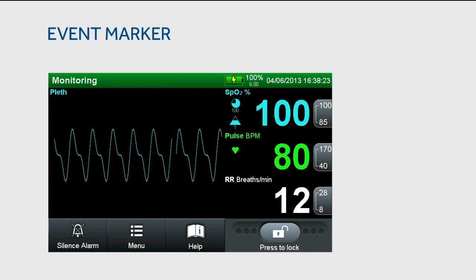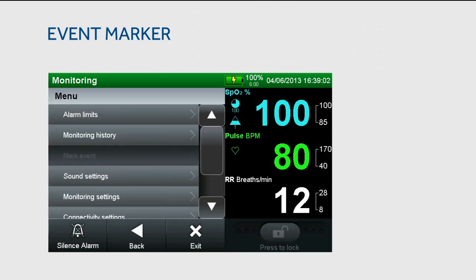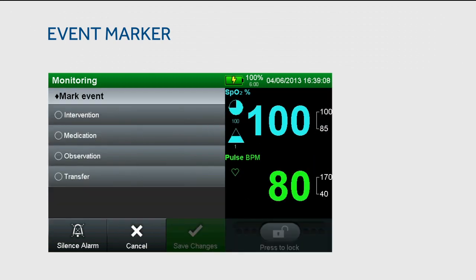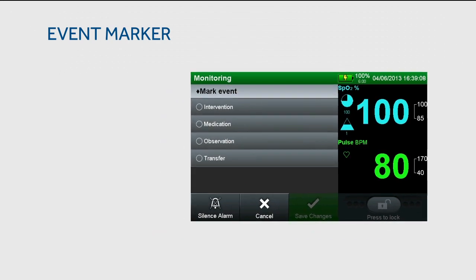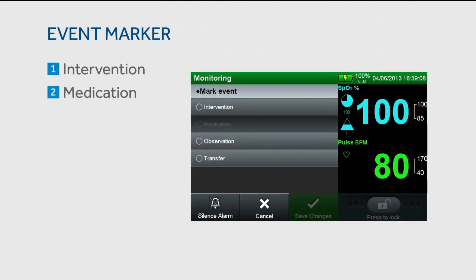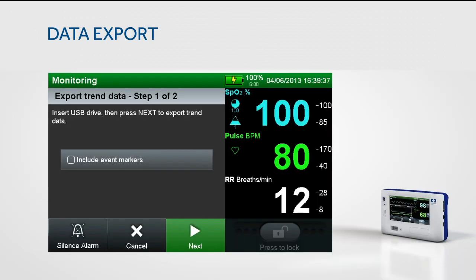Users can mark changes in patient monitoring status by adding an event marker. To do this, press menu and then select mark event. There are four options to choose from: intervention, medication, observation, or transfer. You can also download patient data using the functions in the data export submenu.